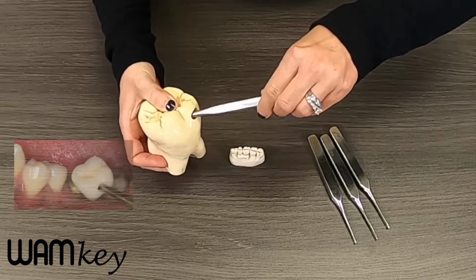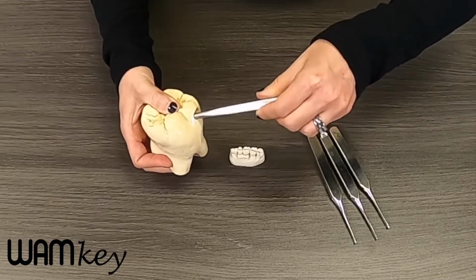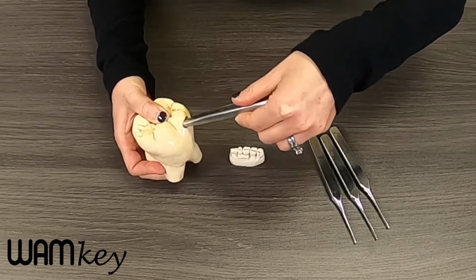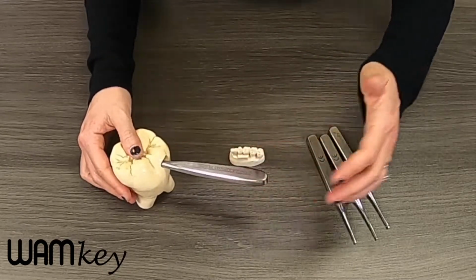It's a very common question that we get from a lot of doctors: do I twist with it? Do I push with it? Do I pull with it? What do I do? So make sure that you twist with it. It's not designed to take any wedging force. You don't want to do that because that could potentially break the instrument.